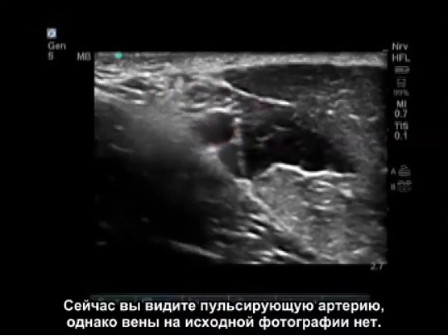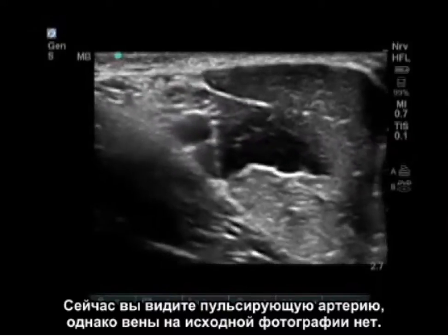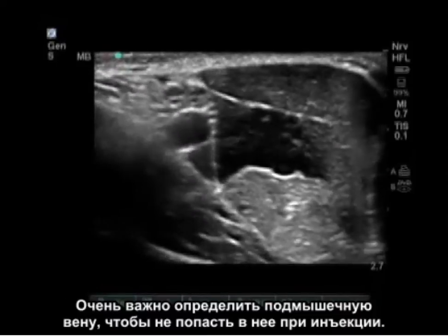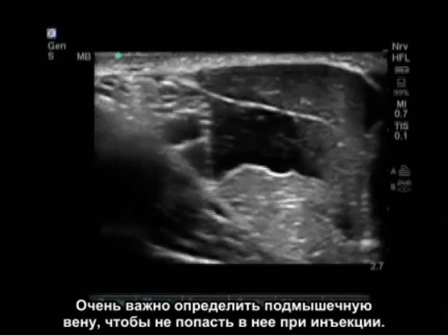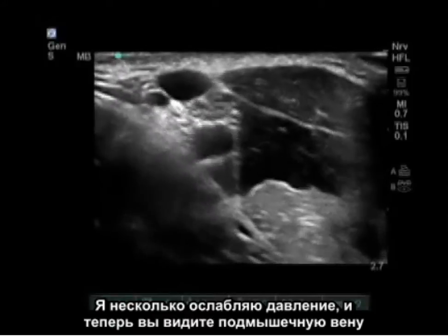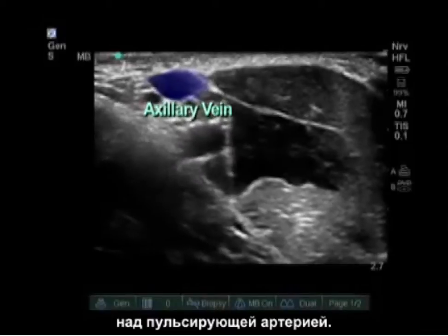As you can see the pulsating artery, there is no vein in my initial picture. This is because the vein is collapsed with light pressure of the probe. It is very important to identify the axillary vein so you do not inject into it. As I let up some pressure, you can now see the axillary vein superficial to my pulsating artery.